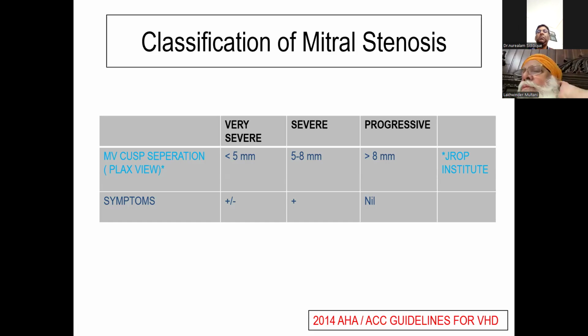I went in to calculate the mitral area now by continuity equation. And when we calculated the mitral area by continuity equation, the area was not matching with the mitral area by planimetry. Can you tell me what could be the cause in that patient? Mitral valve prolapse.